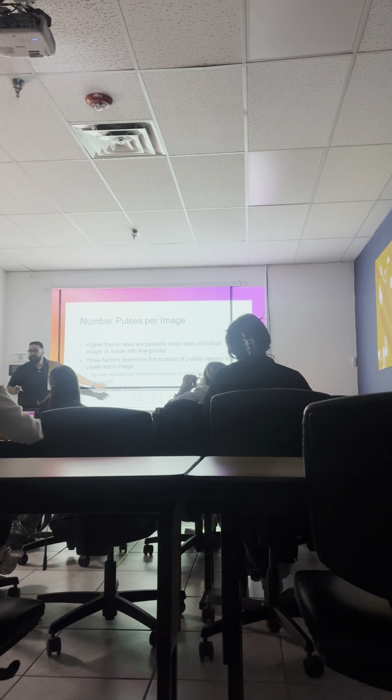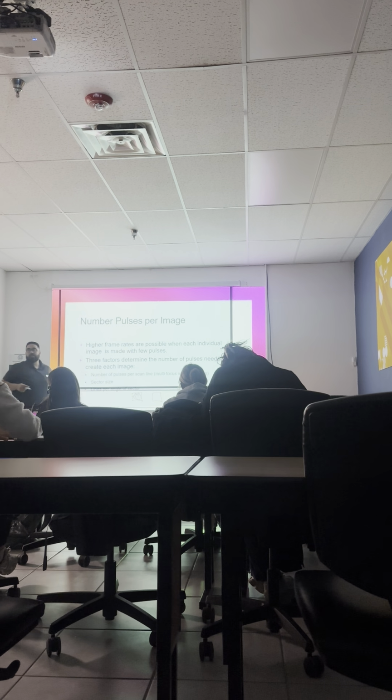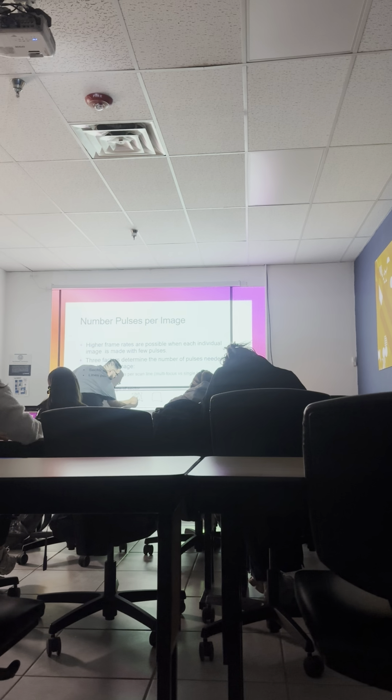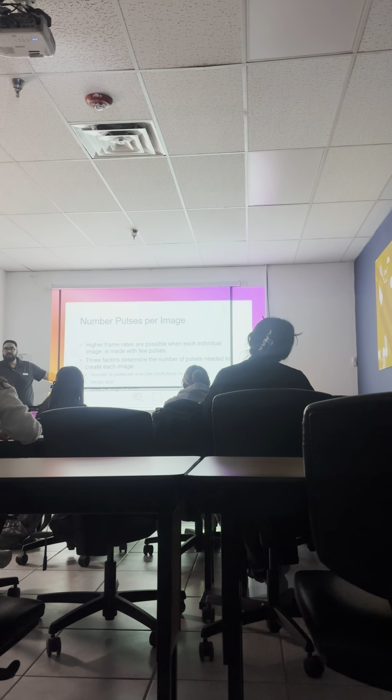Like that, right? Okay, so each of these has an angle. So if we're imaging our liver, right? If we're imaging our liver, what do you think the liver is going to look like with that type of line density, of that many lines?